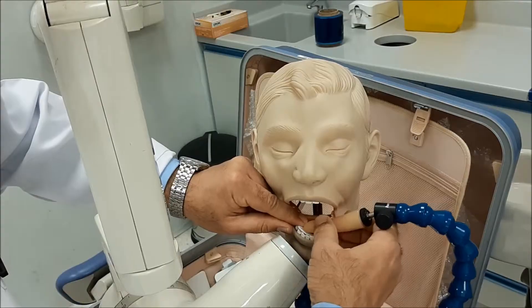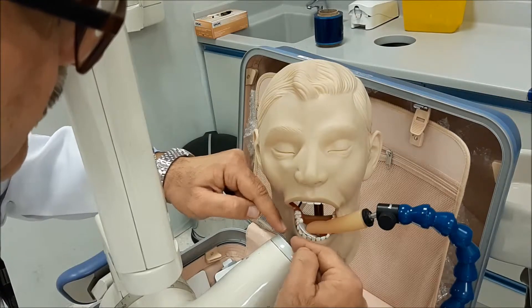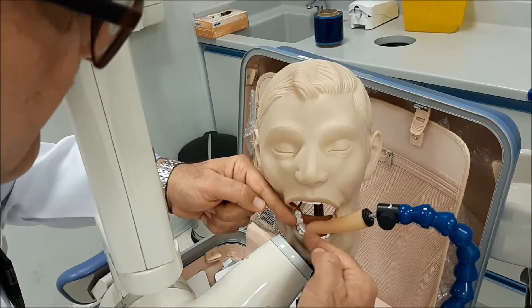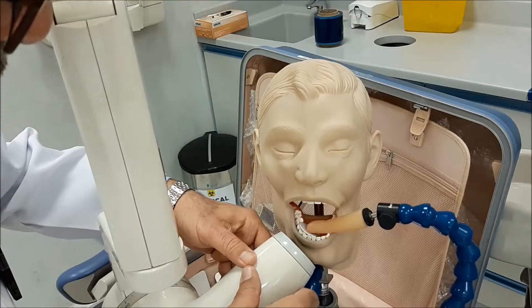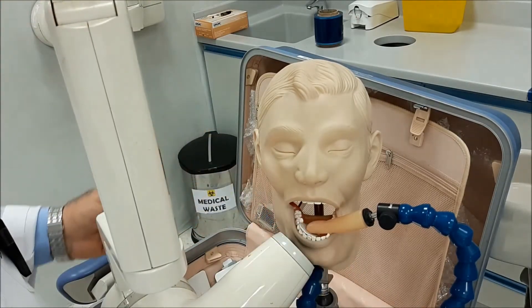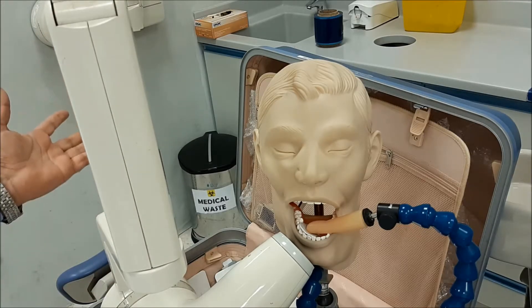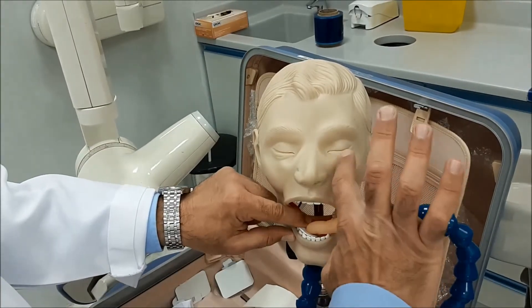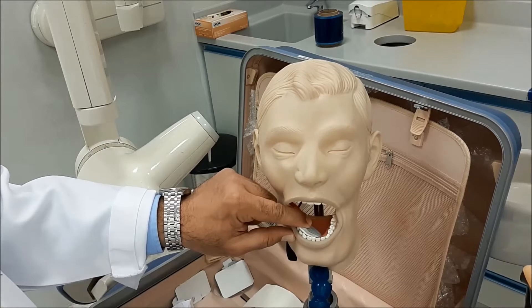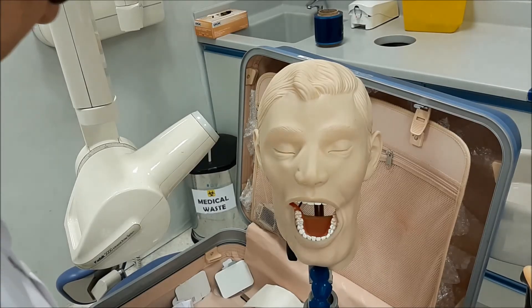The last thing to take care of is complete coverage of the sensor. Look at the two millimeters extending over the incisal margin and make it flush with the cone so that you avoid cone cut and assure complete coverage of the tooth. Then expose, tell your patient not to move after exposure, hold the patient's finger away from the field, and simply take the sensor out of the oral cavity. The exposure is done.